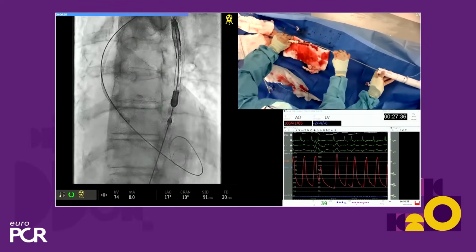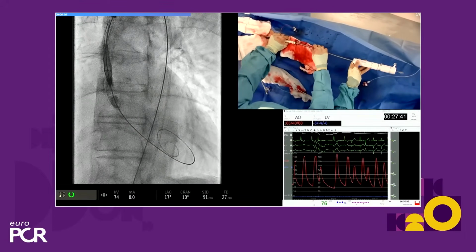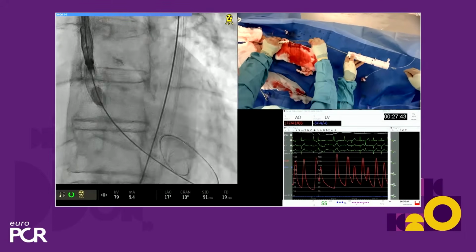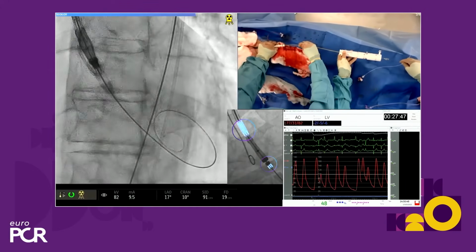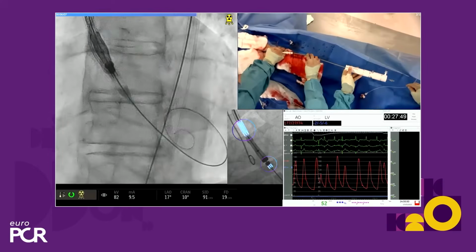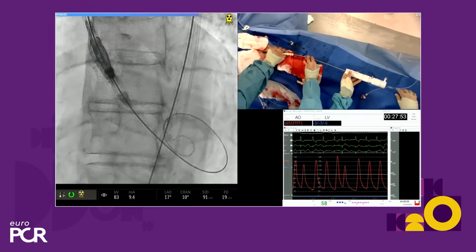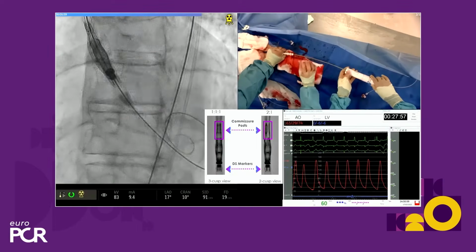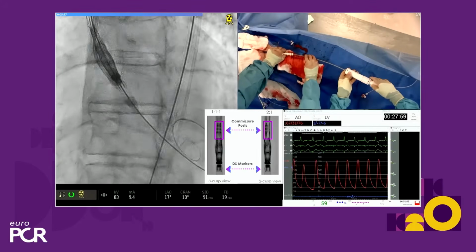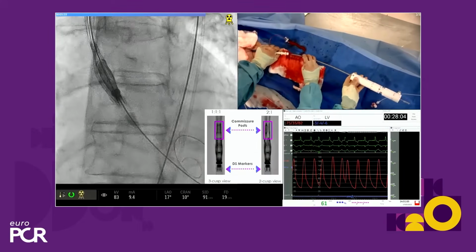We usually take the arch in one, and then mag up over the annular plane, crossing through with the nose cone, and positioning our central marker about the top level of the pigtail. And it's in that position we're going to start looking at commissural alignment. And I think you can just see we're in a slight 2-to-1 position there.